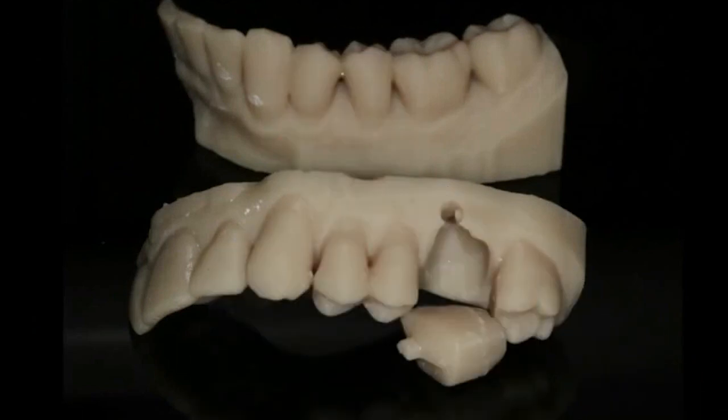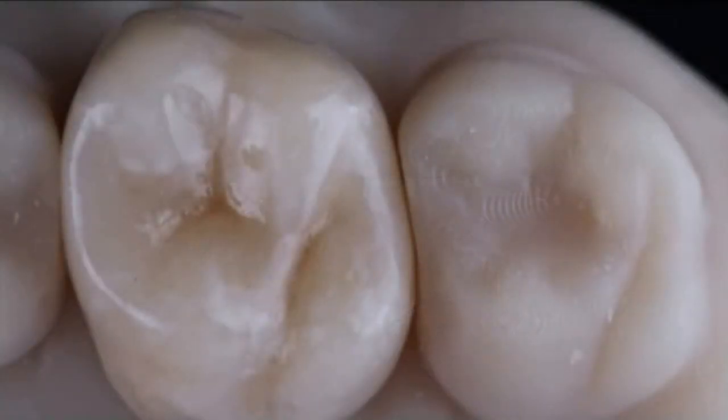Okay. So the power of 3D printing, the first thing that I did was print models here. Let me take myself here. I printed some models. I want to see the fit because I'm starting to work with these materials, correct? So I want to see the difference or the comparison between printed and other materials like Emax, Suprinity, and Cerasmart Duo. In this case, we use Cerasmart Duo. So this is already the printed crown. We glazed it, we stained it like we do to ceramic, and the result is so beautiful.